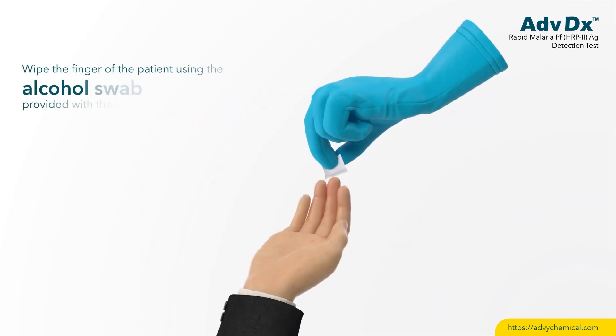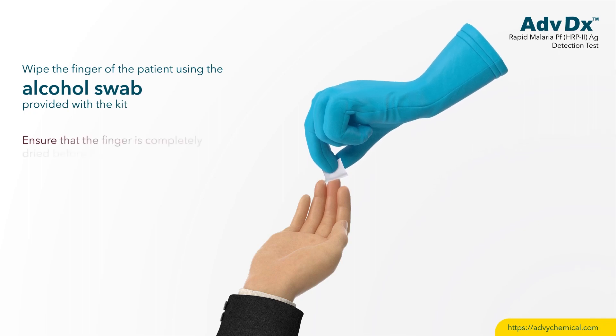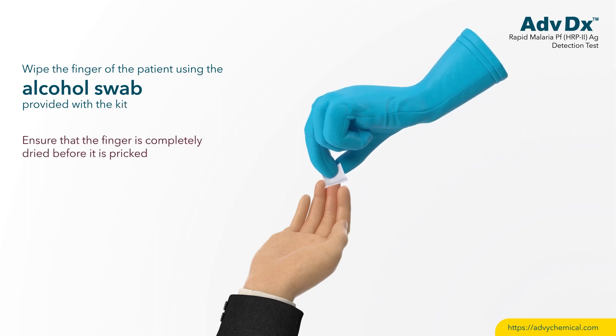Wipe the finger of the patient using the alcohol swab provided with the kit. Ensure that the finger is completely dried before it is pricked.